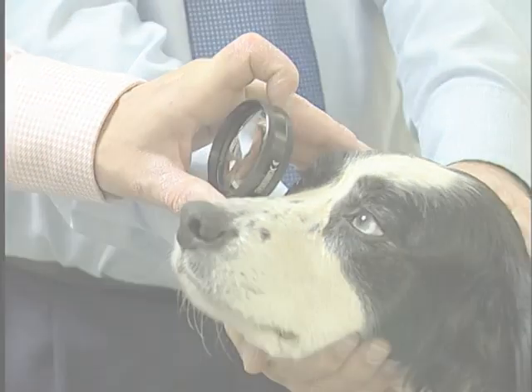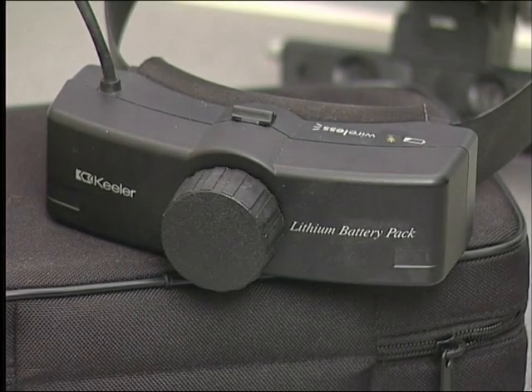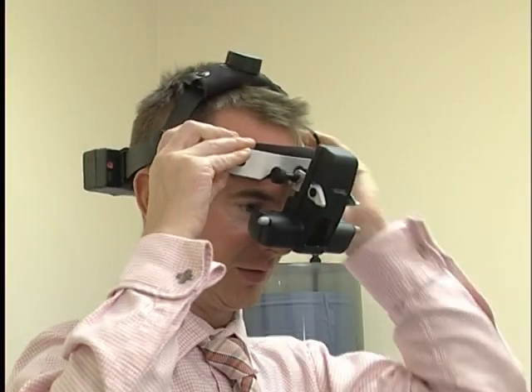Indirect ophthalmoscopy can also be achieved with the aid of a head-worn binocular indirect ophthalmoscope. This has the added advantage of providing a free hand to stabilise the patient, and as the light source is mounted within the optics, prevents it from being out of visual alignment and decreasing the visual illumination.